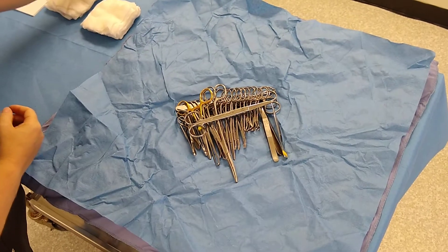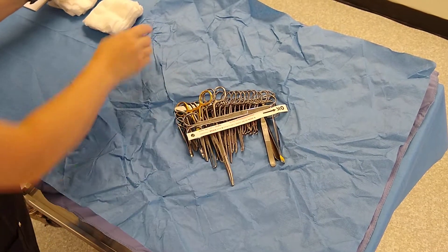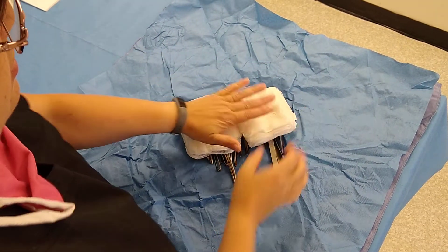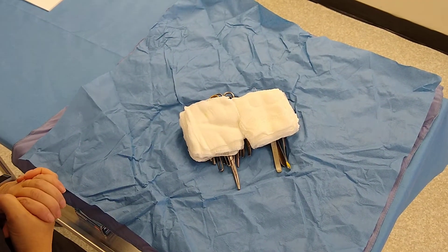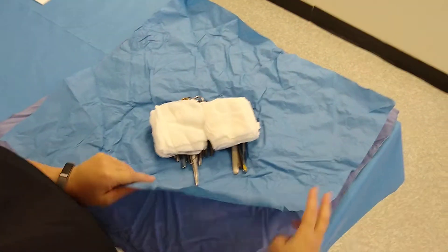Place your indicator strip — yours won't have the 'okay' on it already, I'm just using a previous one. Then place your gauze squares on top of that. You can see how everything is nice, neat, and flat.